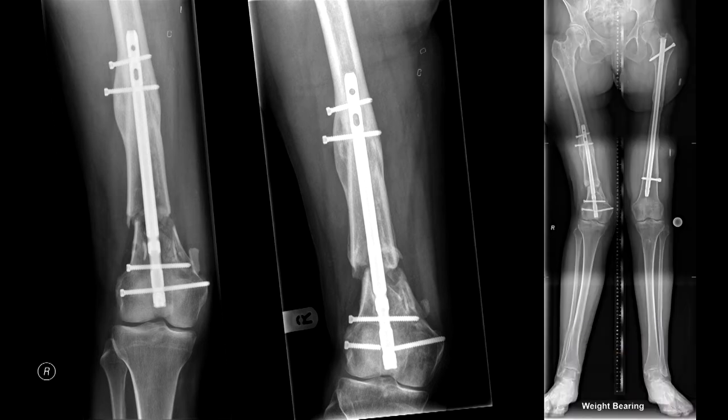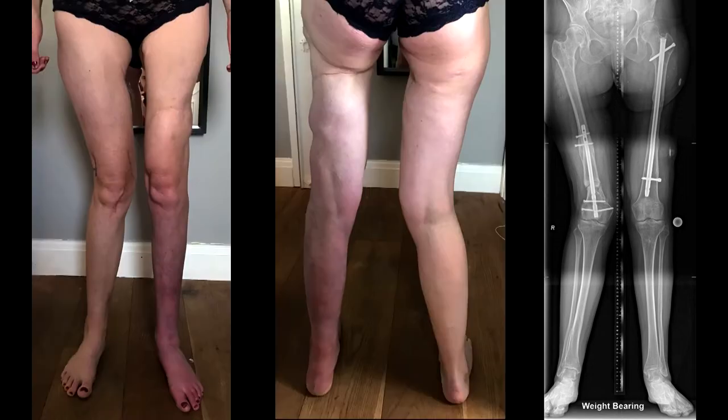These are standing alignment views, and we have some clinical photographs that she's aware we're using. She provided the pictures. So she's got pretty significant valgus, and we'll come on to look at that in more detail in a minute. She had knee pain, she's got leg pain.